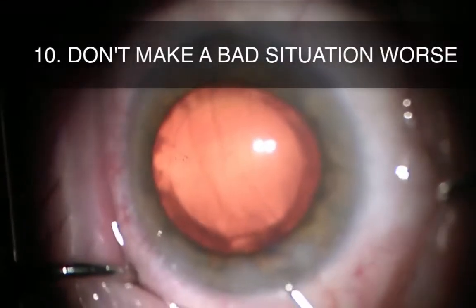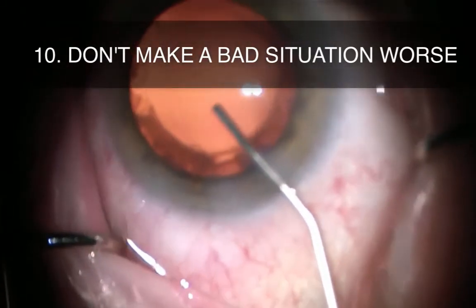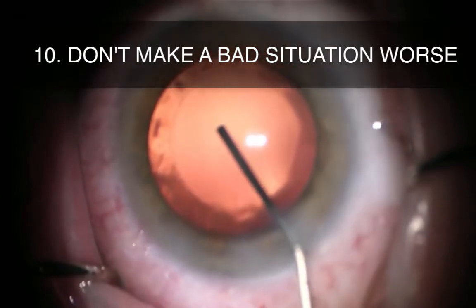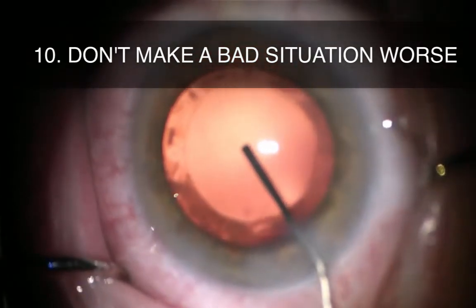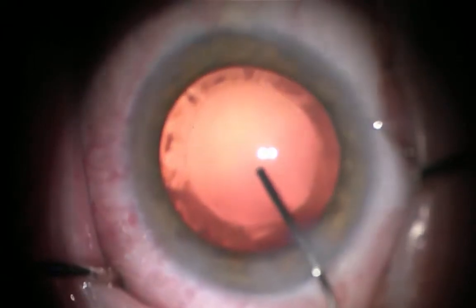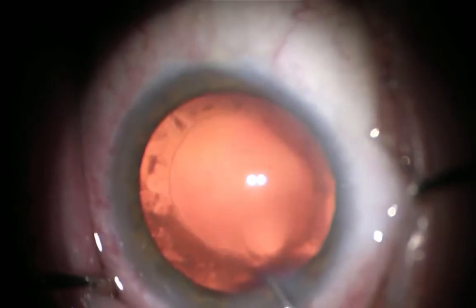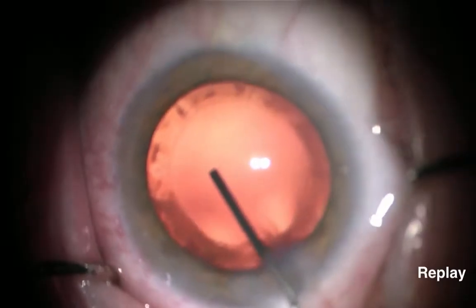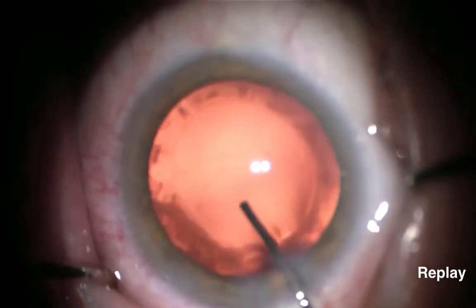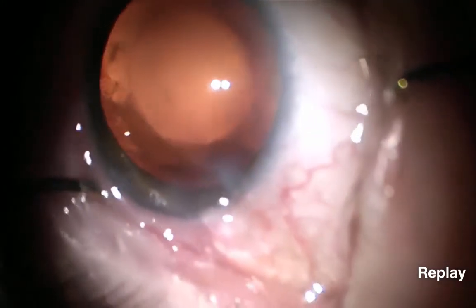The final tip is to avoid making a bad situation worse. After prolapse, the iris architecture has been disrupted, and even a seemingly simple step like inserting the IOL could catch the peripheral iris and cause an iridodialysis. Notice here the subtle pause after inflating the capsular bag to place viscoelastic right below the main wound to then create more space for IOL insertion.